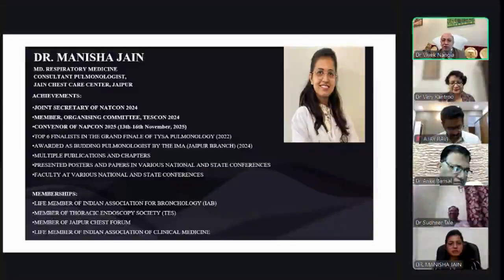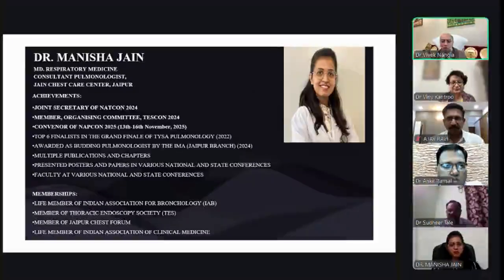No, it's not just for cancer that we do biopsies. We do it even for inflammatory conditions, even for infective conditions. How often we send the endobronchial tissues and the transbronchial tissues, even for cultures, for microbiological diagnosis as well. So biopsies have actually revolutionized pulmonology and intervention pulmonology to a large extent. So let me start with some basic questions and ask Dr. Tale, what are the indications for biopsy during a bronchoscopy, Dr. Tale?